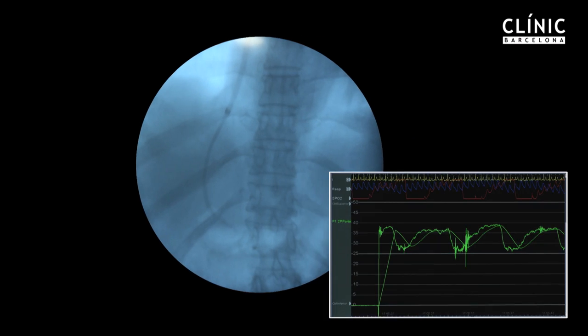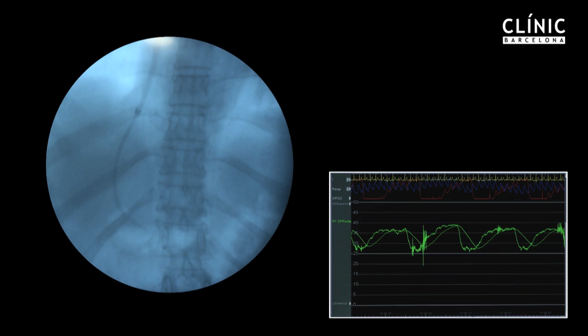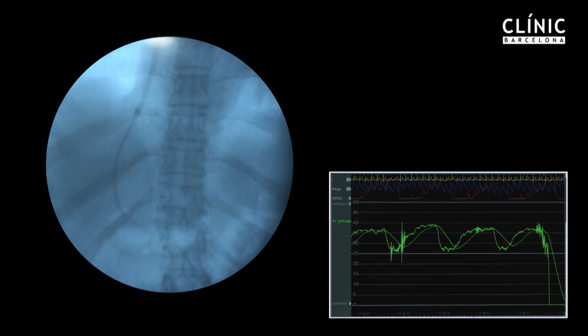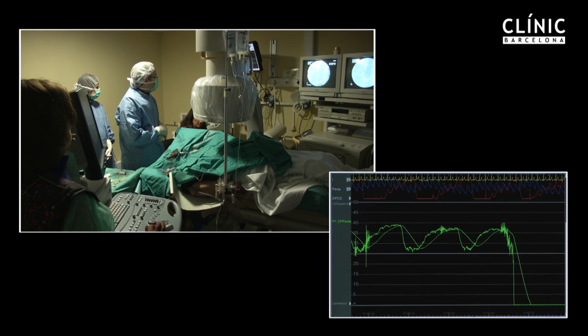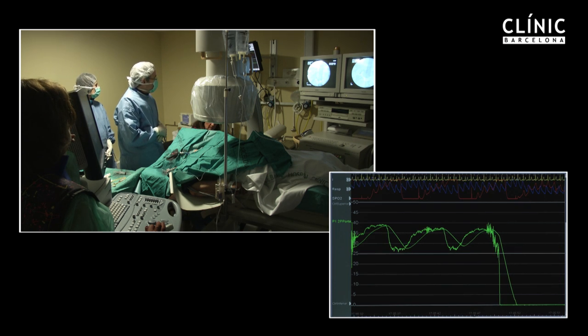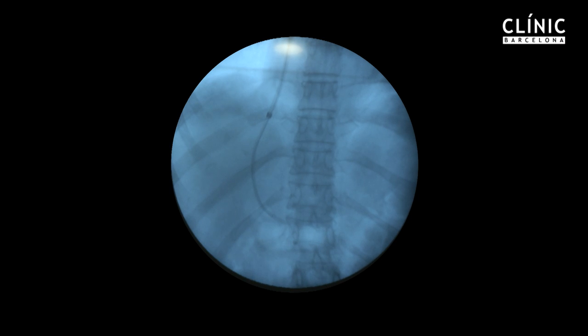Because of sedation and the deep breathing of the patient, portal pressure measurements show marked oscillations, making interpretation of the results rather difficult.